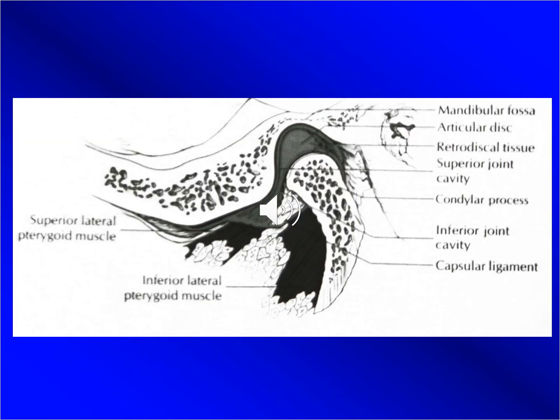Now here you can see the complicated anatomy of the temporomandibular joint and how it is related to the inclined surface of the glenoid fossa. So with any translation, it has to move downwards. And that is one of the main focus points for articulators to be programmed accordingly to reproduce that separation that's going to happen between the mandibular and maxillary occlusal planes that is dictated by the condylar elements and the anterior contact of teeth.